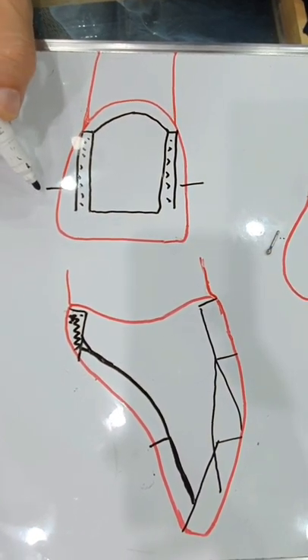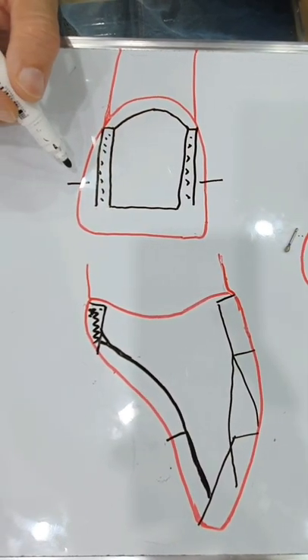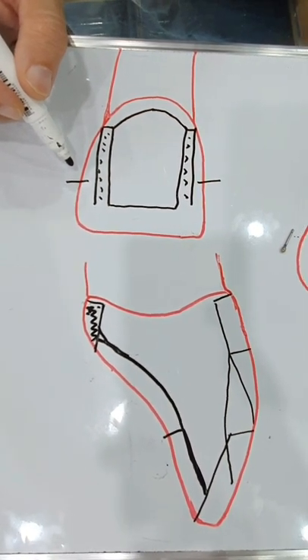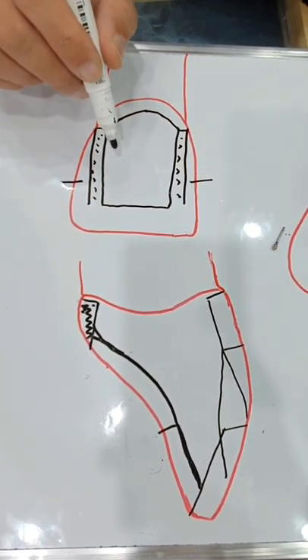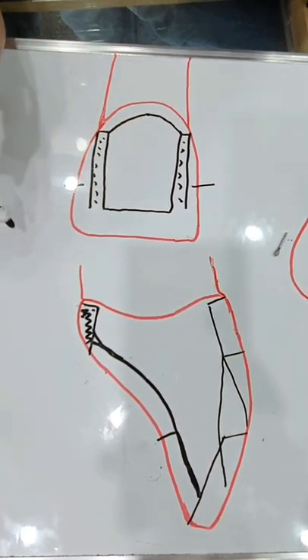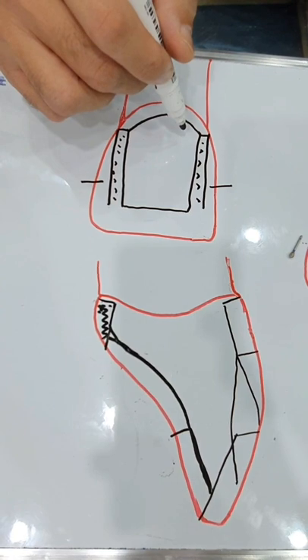There is no reason, if you were to use this technique, for you to end up nicking the adjacent tooth. And remember, clinically it's a failure, it's damage to the adjacent tooth, and you're professionally liable for that. It's malpractice to nick the adjacent tooth. Please don't nick the adjacent tooth. I have seen many crowns where I had to redo the crown. When I took the crown off, I saw a large decay of the adjacent tooth, and I could see the flat interproximal contact because somebody just cut through the contact when they were prepping the tooth that we are repairing.